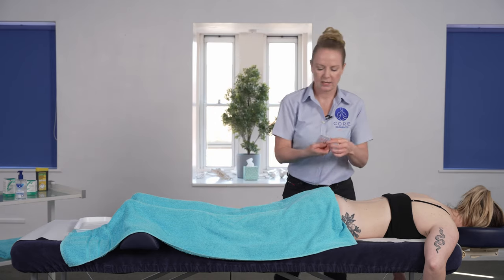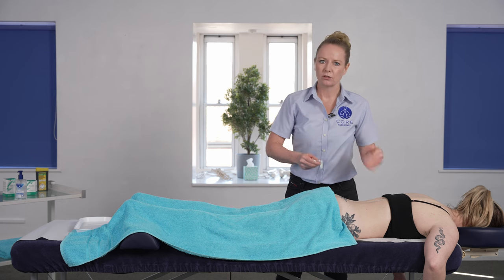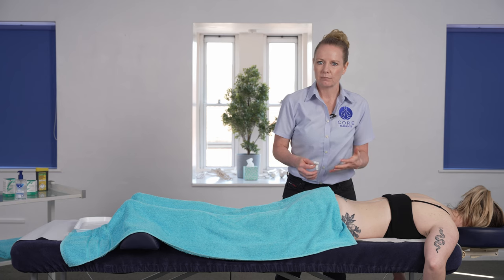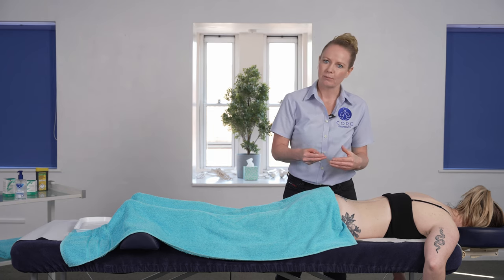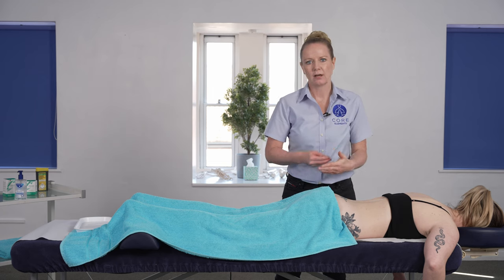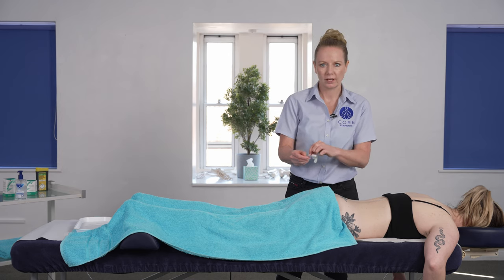We're going to be using those 25 millimeter needles in length. The length of the needle is often dictated by the size of the client and the size of the musculature. If you've got a smaller client with less muscle mass then we might want to use a slightly smaller needle, versus a larger client with more muscle mass and more bulk — you might then want to use a slightly longer needle.